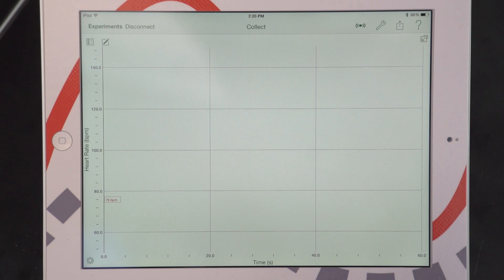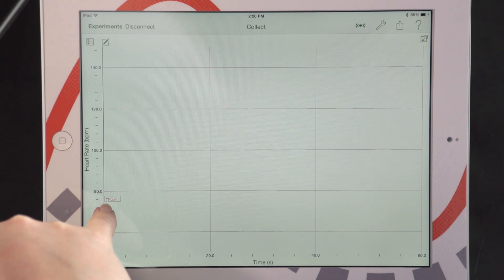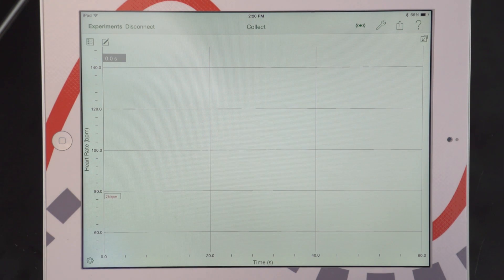Once it's connected, you can see I actually get a live readout over here that's showing on my graph. And that's nice because it shows me that I am actually connected to the Go Wireless Heart Rate.